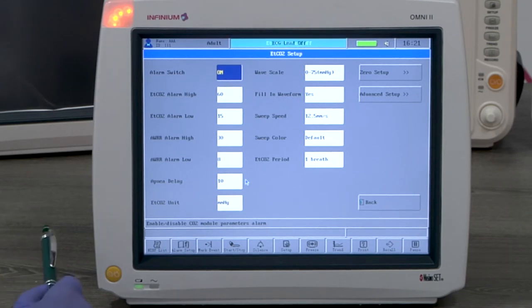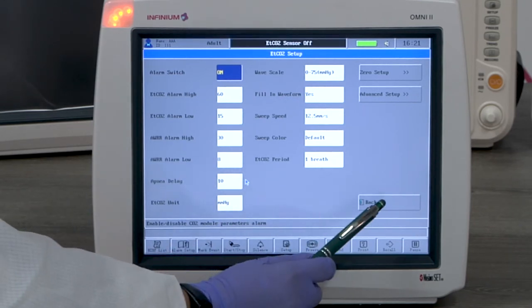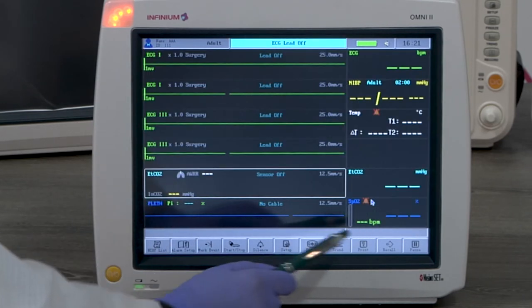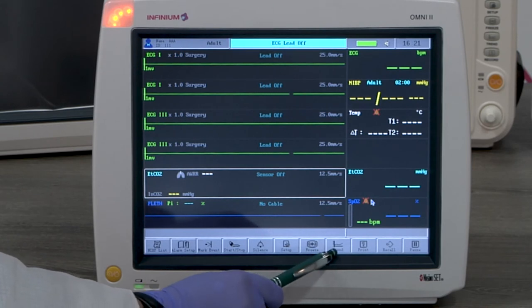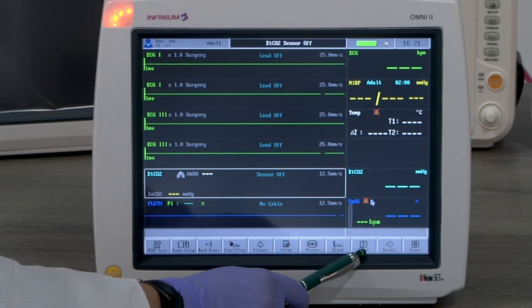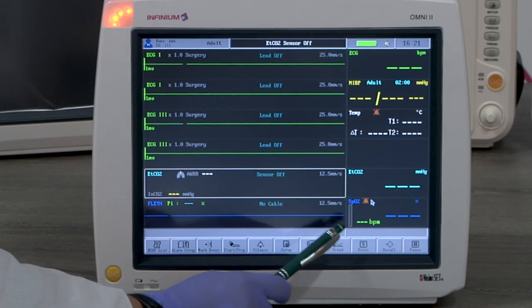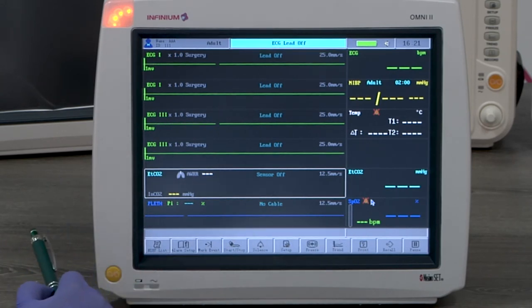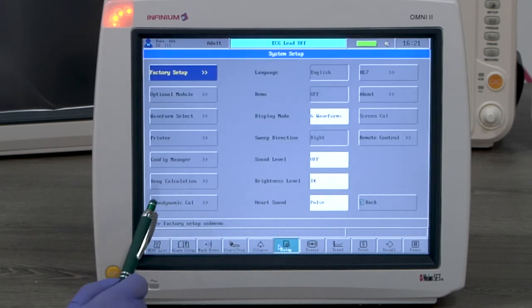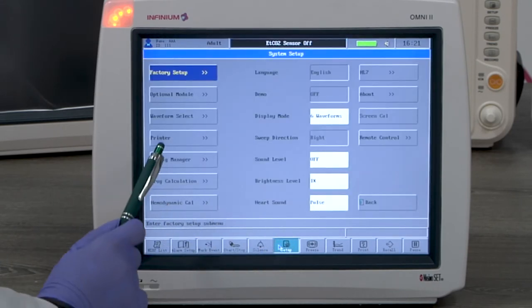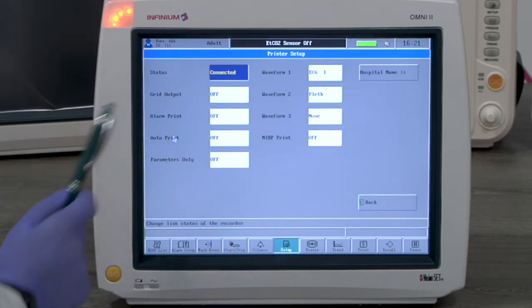Now let's take a look at printing. The print button activates the printer to print an eight-second real-time waveform and reading. Printer settings are under the setup menu. The status will be connected if a printer is installed.